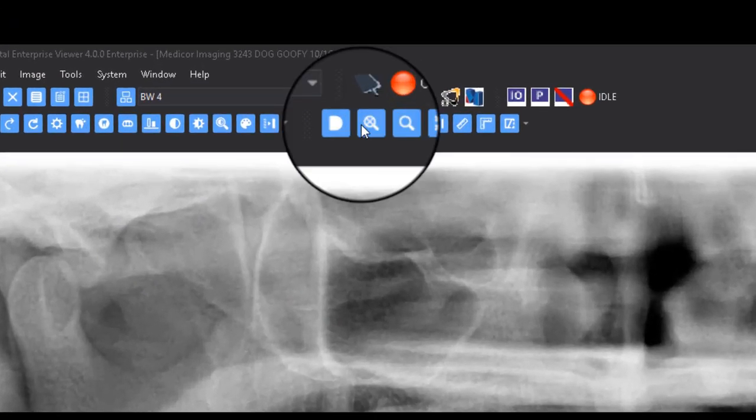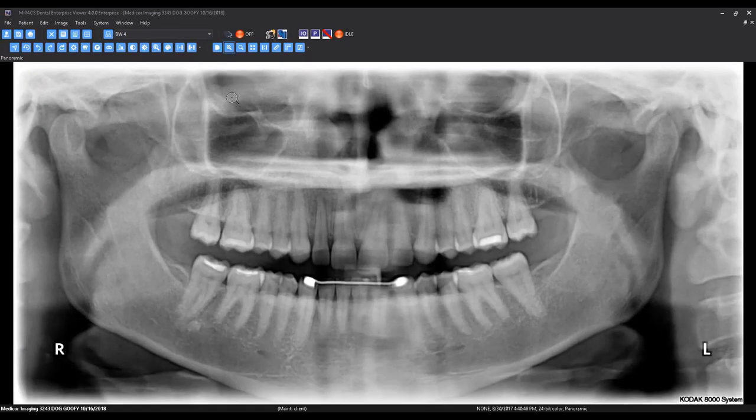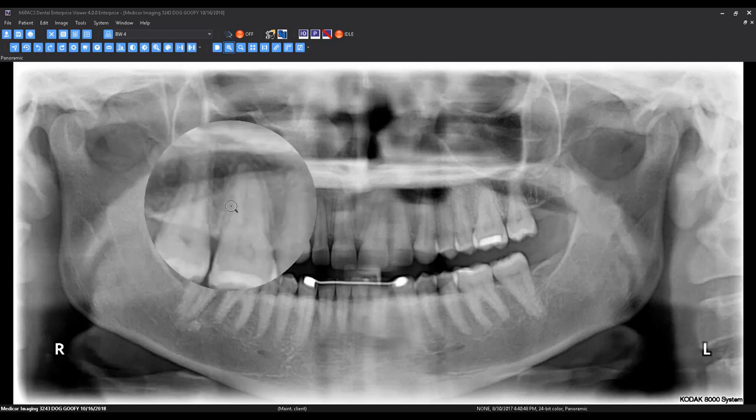With the magnifier button activated, left-click and drag across an image to magnify the selection.